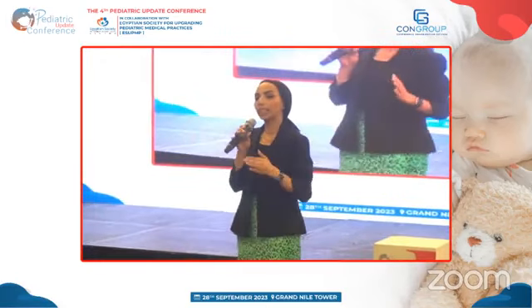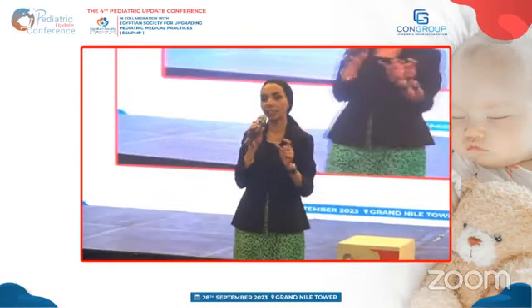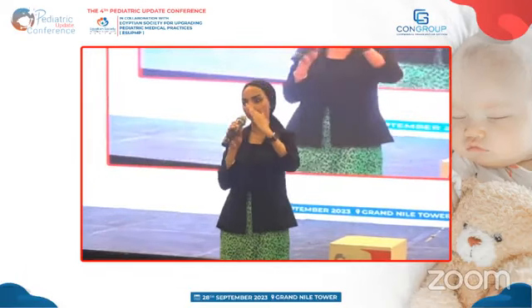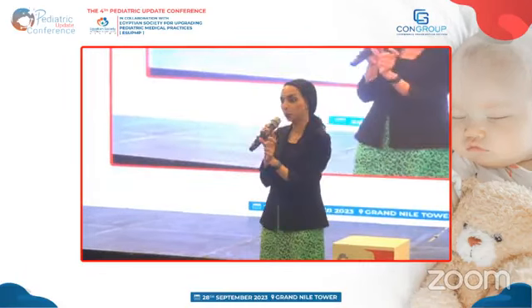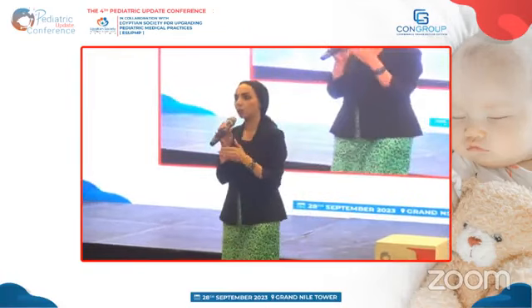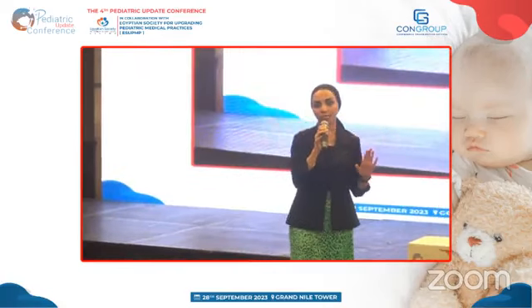لو البيشنت ما دخلش خالص الدوز، البامب هتعمل اوتو كوركشن، بس هيبقى النتيجة ان هيكون في سبايك السكر اوريدي، هيبقى عادي على ما البامب بتاوتو كوركت، فانا هكون ضيعت وقت من يومي وانا في الهايبر جلايسيميا. يبقى انا التارجت بتاعي مع البيشنت انه يعمل اناونسمنت للميل ويعمل الدوز قبل الاكل، هو ده بس اللي انا عايزاه منه وهو بيستخدم ال 780.